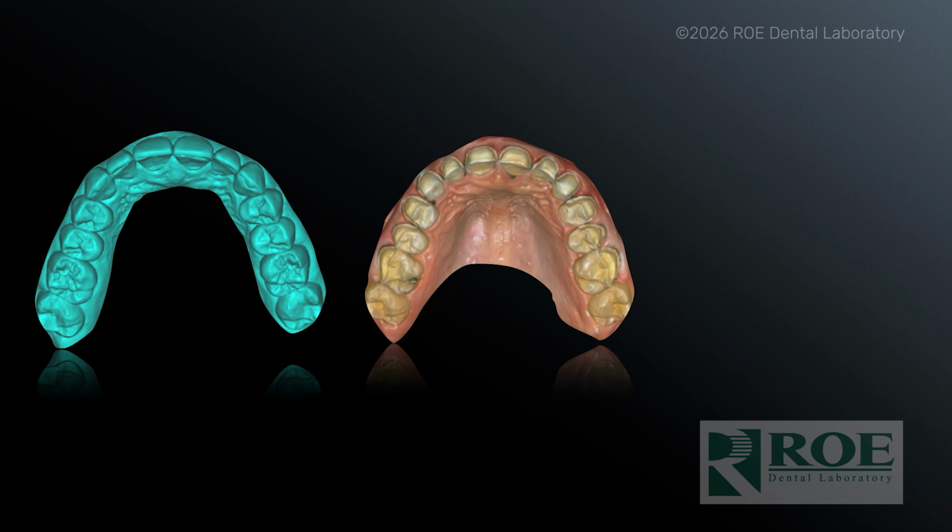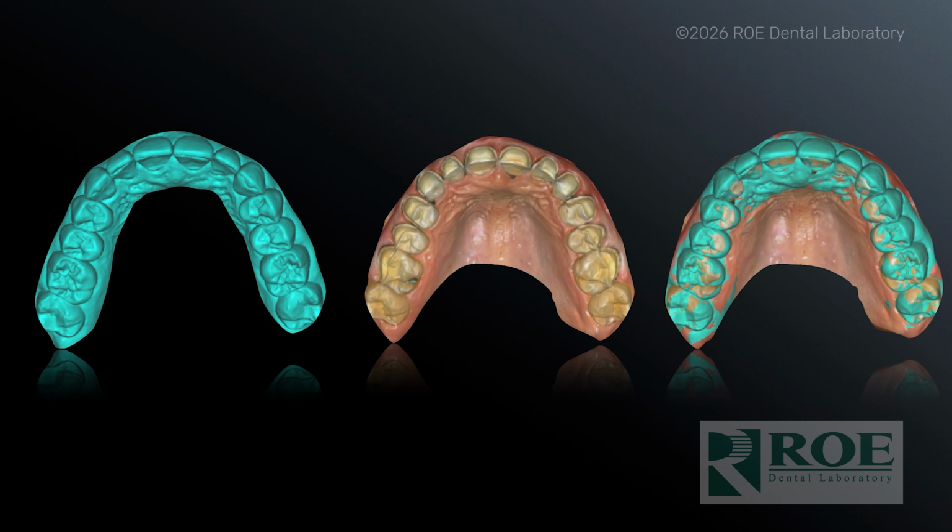And what we're going to do that same day, I've pre-scheduled this. And so I've told the lab, hey, we're going to do this. And based on the number of units, it's going to be a 1 hour or maybe up to 2 hour if it's a double arch. But they're going to then convert everything here for me.